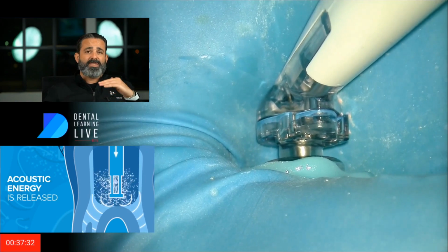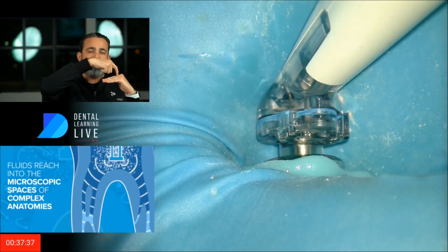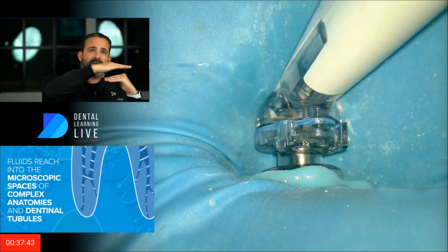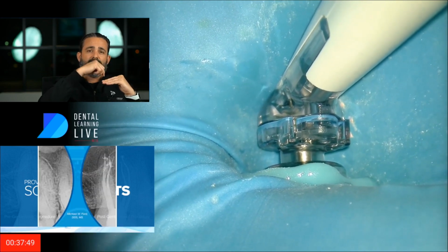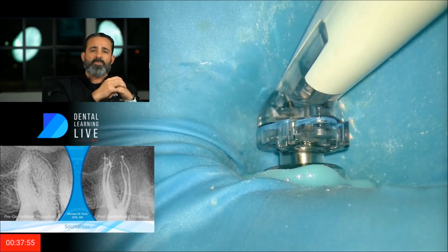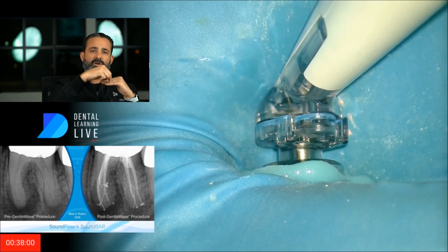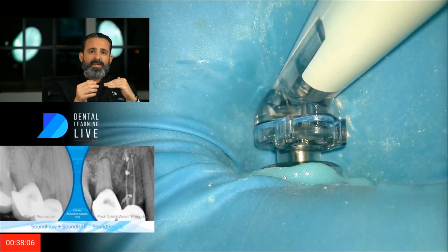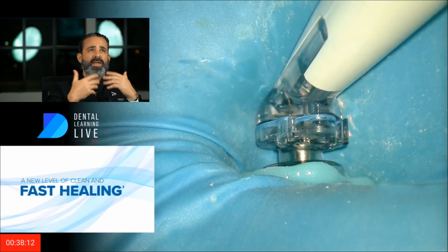I hope it does. But the idea is, if this is my floor, I take the depth gauge, I'm really pushing on it, and there's probably some bending going on. And I'm also moving it around forcefully, because I'm trying to move the top of that Sound Seal. If it dislodges, I'm not going to be happy, and I want to know that before I begin. Some guys do the perio probe, but with a perio probe, it might find different depth heights along the floor, and it's really hard to scratch all across, and my hand might go up and down if I measure. So for me, it was easier and faster just to go tactilely than visually, for instance. And that's my logic.